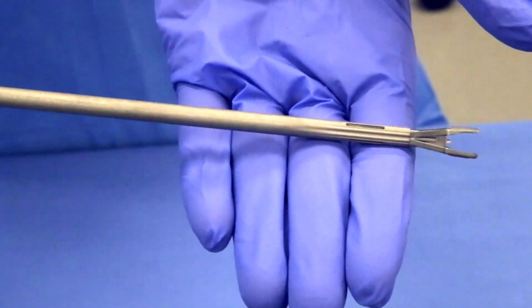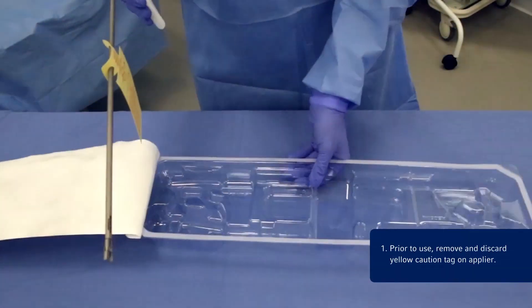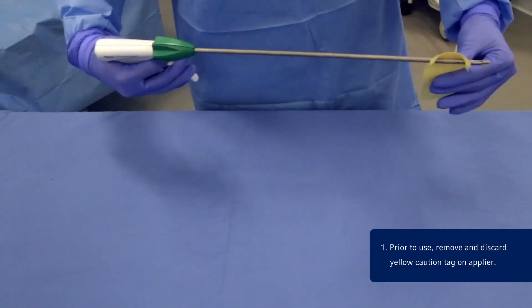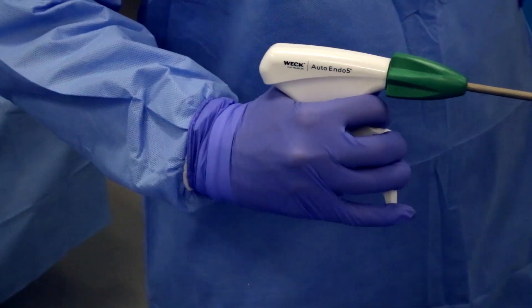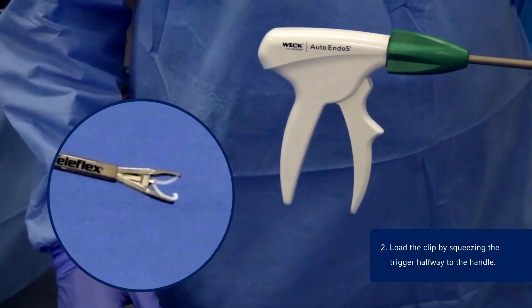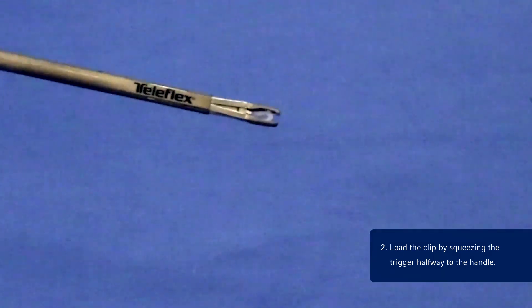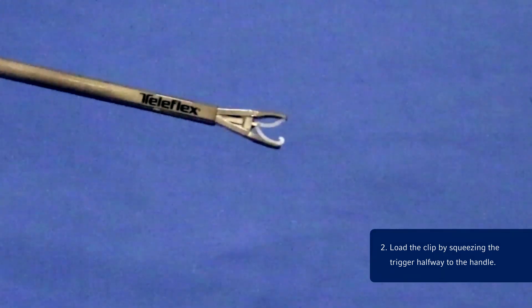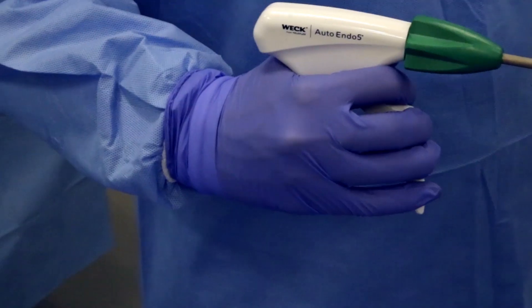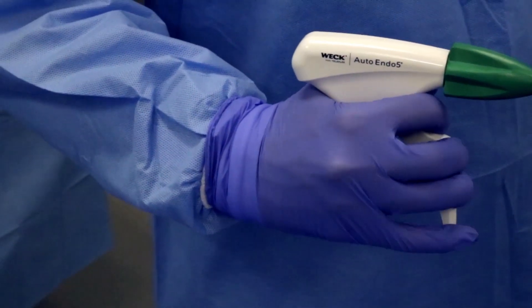Using the Auto Endo 5 Clip Applier. Step 1: Prior to use, remove and discard the yellow caution tag on the applier. Step 2: Load the clip by squeezing the trigger halfway to the handle, advancing a clip into the jaws until it has reached its full aperture. Visually confirm that the clip is positioned in the jaws. The enhanced ratcheting trigger provides distinct tactile and auditory feedback during the loading and firing process.